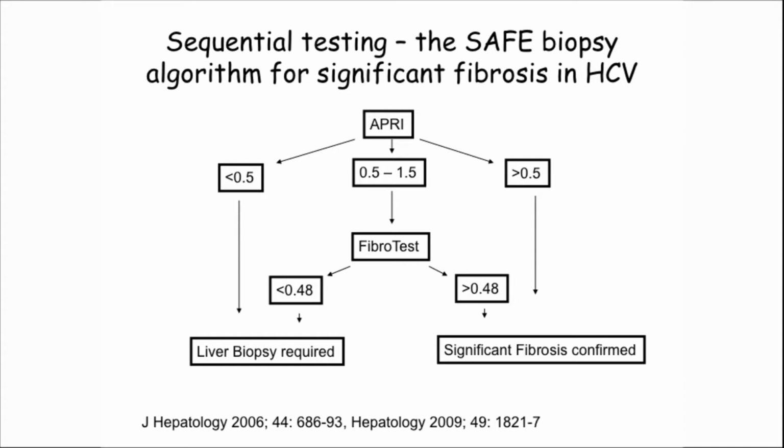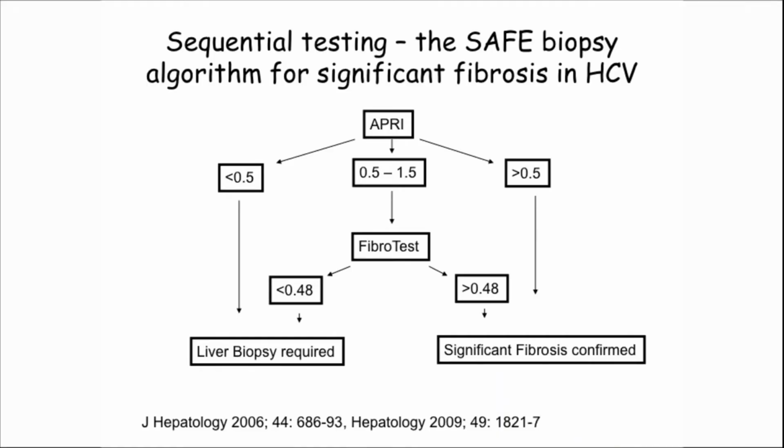So in terms of clinical use, certainly very useful in the diagnosis of cirrhosis in patients with viral hepatitis. And so you can actually say to people, you've got advanced liver fibrosis and you need to go on for hepatocellular carcinoma monitoring and for complications, portal hypertension. It's very useful in treatment decisions in hepatitis C, may be useful for monitoring of hepatitis C patients not on anti-hepatitis C therapy, so looking at progression of liver fibrosis.